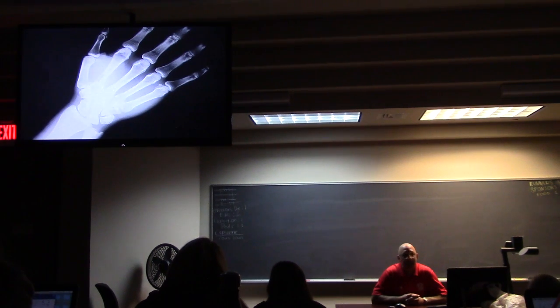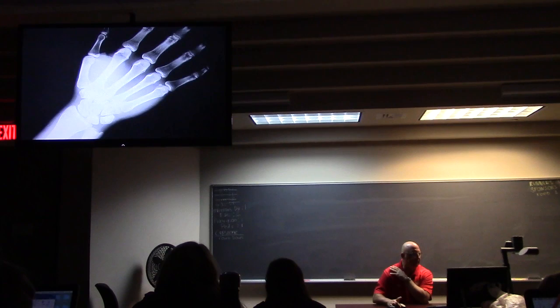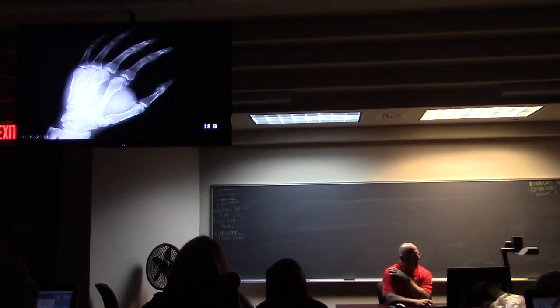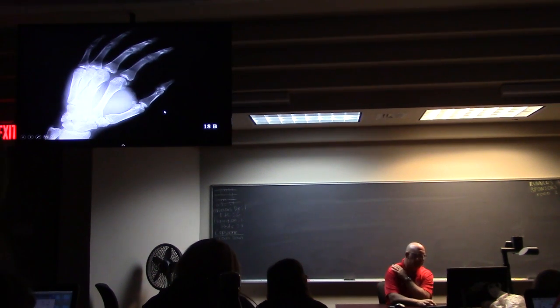Another view. One view is no view. Very good. Same guy, new view. Just like the femur, everything lined up perfectly. See this little lucency right there? Usually you're looking for a break in the cortex. And there's a little lucency there, and a teeny tiny little lucency there. I'm not impressed by those, but on another view, dang, he's fractured all three of those bones. Now I'm impressed. So again, one view is no view.